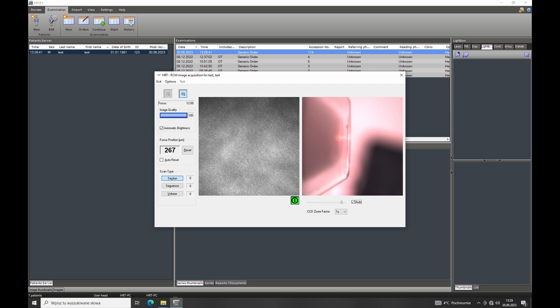On the top you have the laterality, then the image quality index — 100 is the best — and then you have the focus, meaning the depth in the cornea in micrometers. It's very important to always reset to zero when at the epithelium, because then you can determine the thickness of a lesion or infiltrate. There are three ways to capture images: the still image, which is basically a screenshot; the sequence, which is a movie; and the volume scan, where the machine automatically adjusts through depth. You can also adjust the zoom from the external camera.